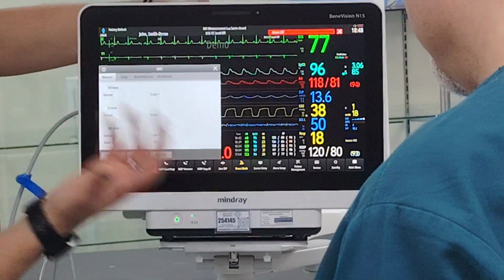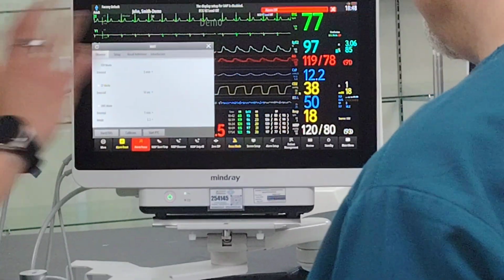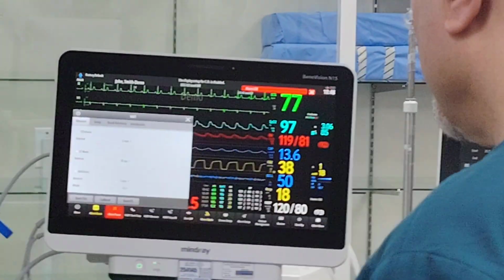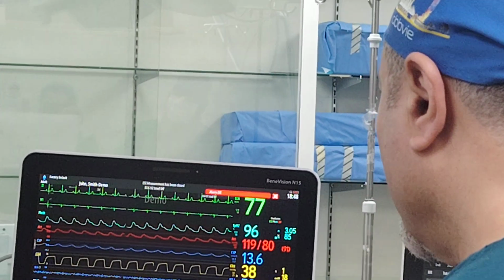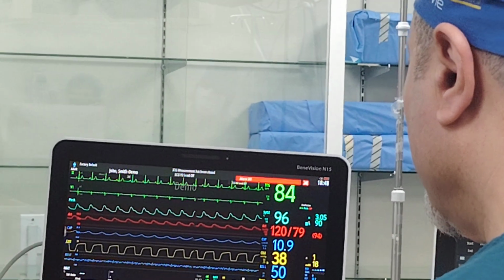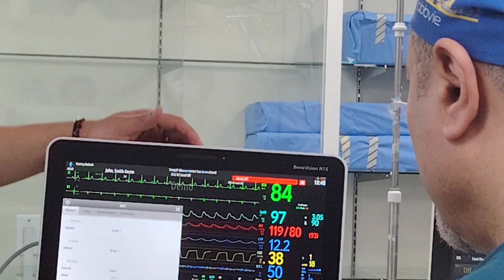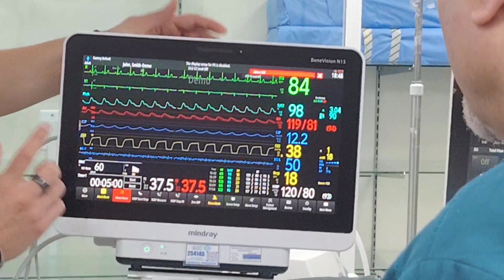Now, after you put everything, you press calibrate, then OK. The machine will do the calibration. You will hear teet, teet, teet, teet. Then it takes the measurement, with another teet, teet, teet, teet. Then you press cancel and you get the measurements from here. This is how the measurements will look. I hope it works in demo mode. When this is finished, yes, you got the measurement.